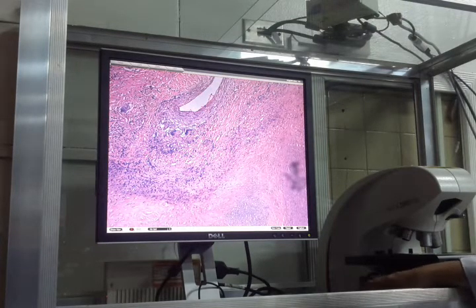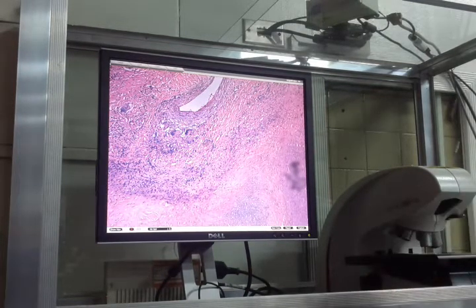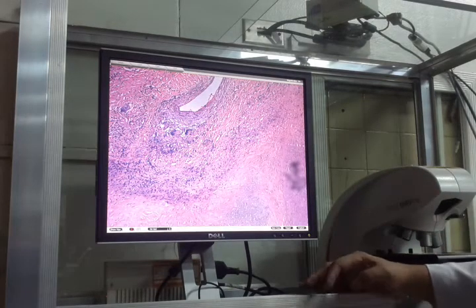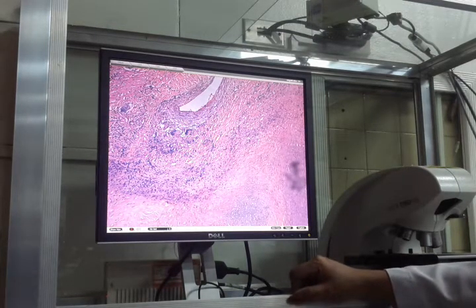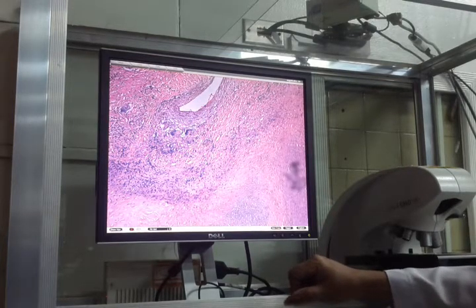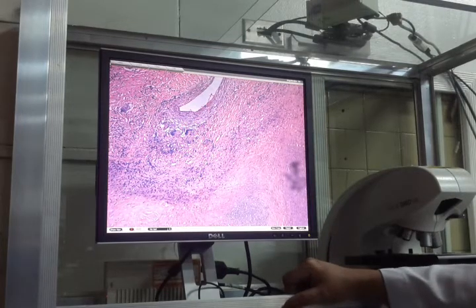So it can be asked in inflammation. It can be asked as injury and repair because it has caseation necrosis. It has a granuloma, that's inflammation, and this is T-cell mediated. So they can ask you immunologic questions with this slide. Right?